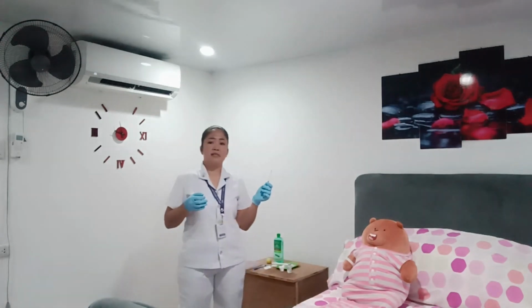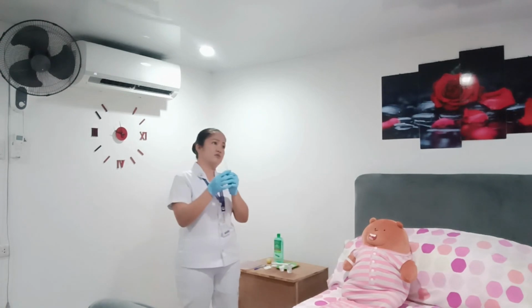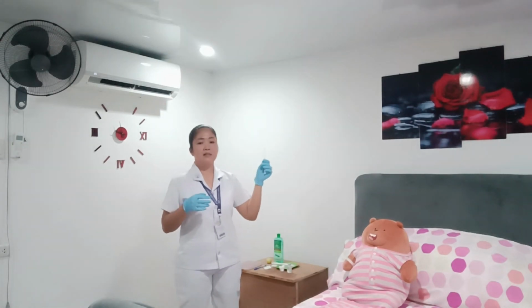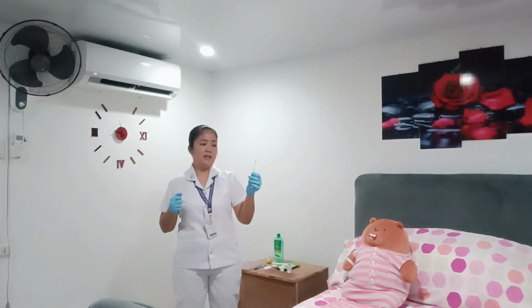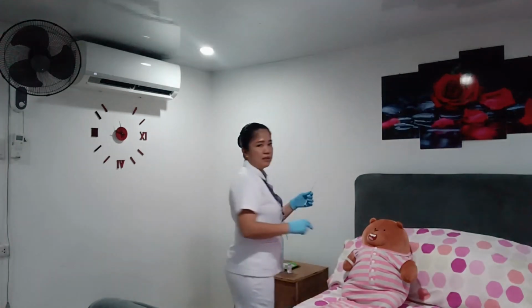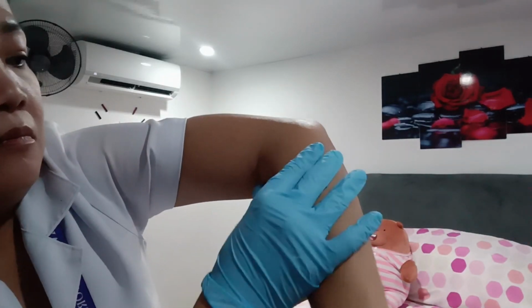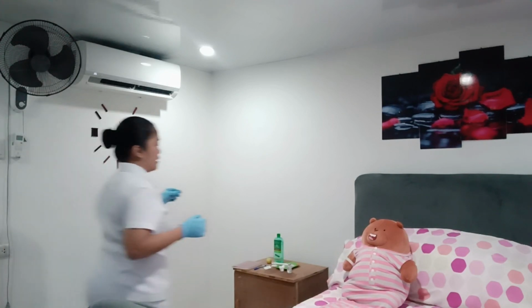I'm going to grasp the syringe with my dominant hand. Actually, I could also use my other hand. I'm left-handed, but I am comfortable with this right, so I assume that this is my dominant. With my other hand, I'm going to grasp the arm of my client, since I'm going to inject into his arm, and then I'm going to do it like this. No, like this. And then at a 45-degree angle, I'm going to insert it.